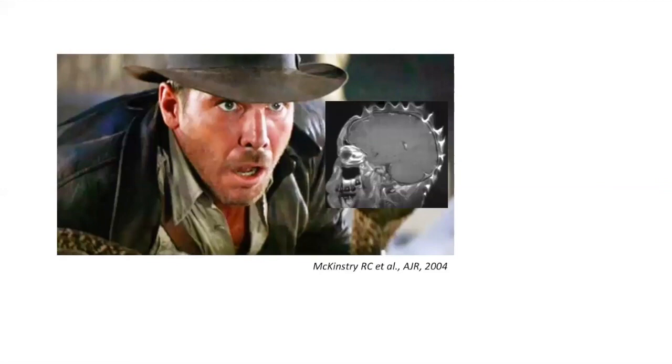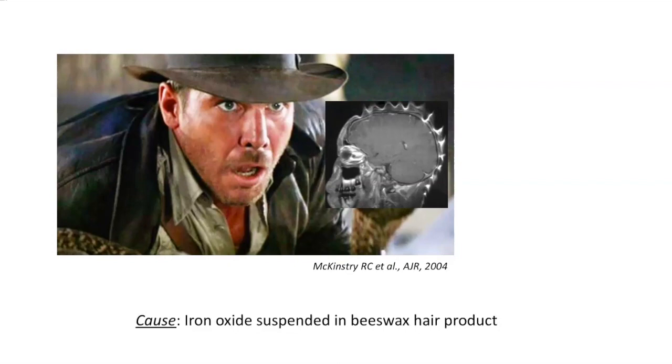With that, I'll just leave you to say that this artifact that I showed at the beginning was iron oxide suspended in beeswax hair product that causes these kinds of susceptibility artifacts. So pretty cool.